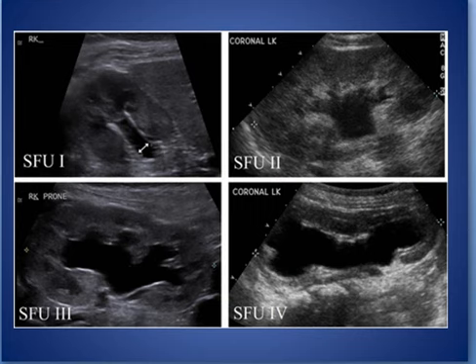Here, this is the grading system of the ultrasound of hydronephrosis according to the Society for Fetal Urology.